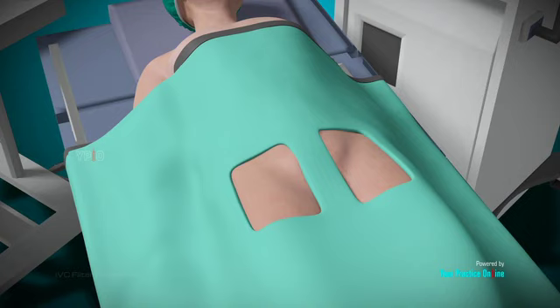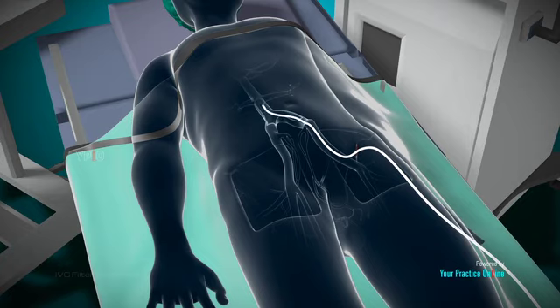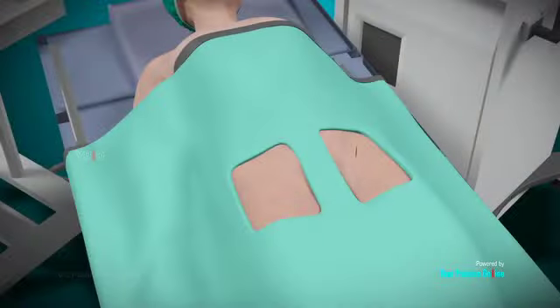During the procedure, your physician will make an incision in a vein either in your groin or neck. A thin, flexible tube called a catheter is inserted into this vein. The catheter is then gently moved into the inferior vena cava under fluoroscopic guidance, real-time X-ray. A collapsed IVC filter is sent along with the catheter. Once the filter is in place and expanded, the catheter is then removed. The incision on your groin or neck will be closed and bandaged. The procedure usually takes about 30 minutes.